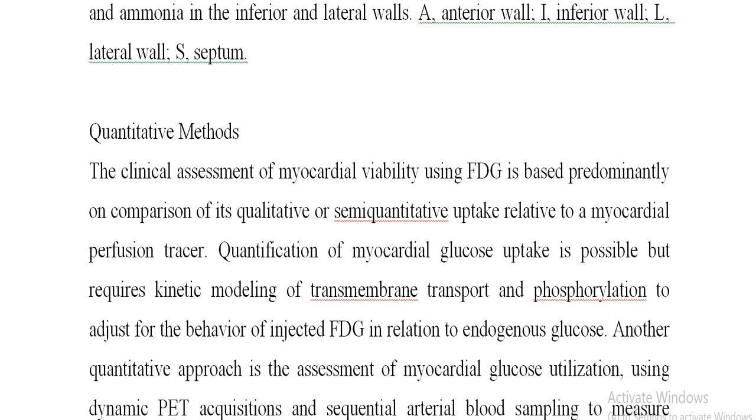Perhaps of equal importance is the ability of cardiac PET to determine absolute myocardial blood flow using tracer kinetic models. Quantitative myocardial blood flow can be measured with dynamic imaging of 13N labeled ammonia, 82Rb, or H215O. These agents can be used to determine regional myocardial blood flow.